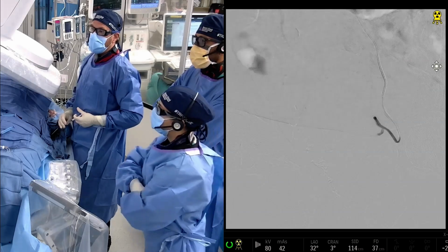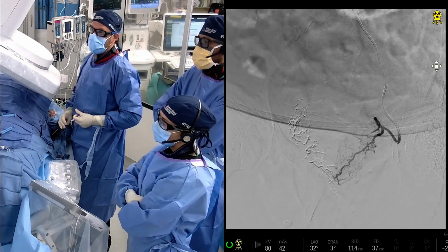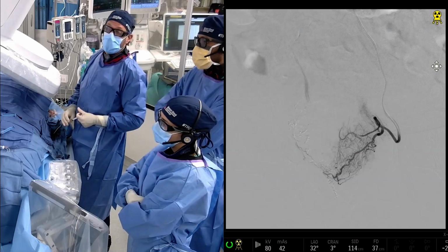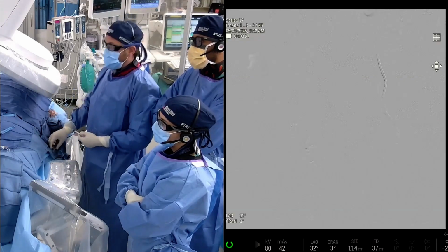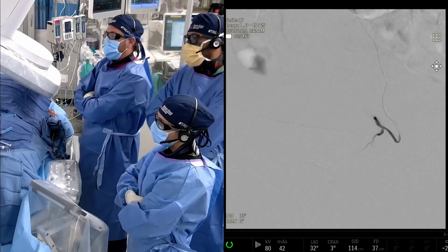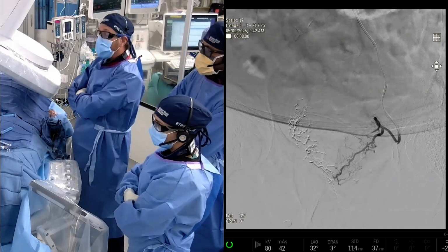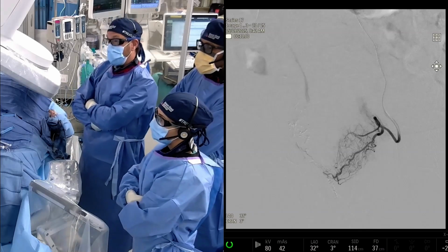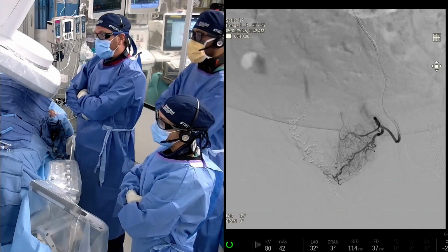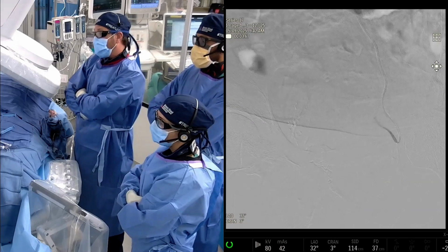And I like this view too. I think this view is really nice to show. Oh, actually, it redirected the blood flow sort of at the bottom part of the prostate, if you guys notice. And it might change actually once we put the balloon up. So that was just the difference between giving nitro and verapamil versus not. And you can see most of the blood flow now is going to that inferior branch. I don't think it's going to make a difference with the balloon up because it's going to be able to inject and pressurize both vessels, but we'll see.